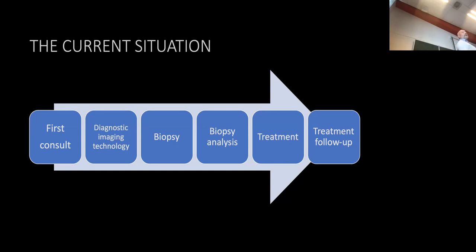And then they go inside the human body with an endoscope, which is a tiny tube with a camera mounted on top of it, and you can look around. Fortunately, within this tube with the camera, there's also what we call a work channel. So you can bring down tools through the work channel to actually execute some work if that needs to be done. And one of the most frequent things that needs to happen is taking of a biopsy.